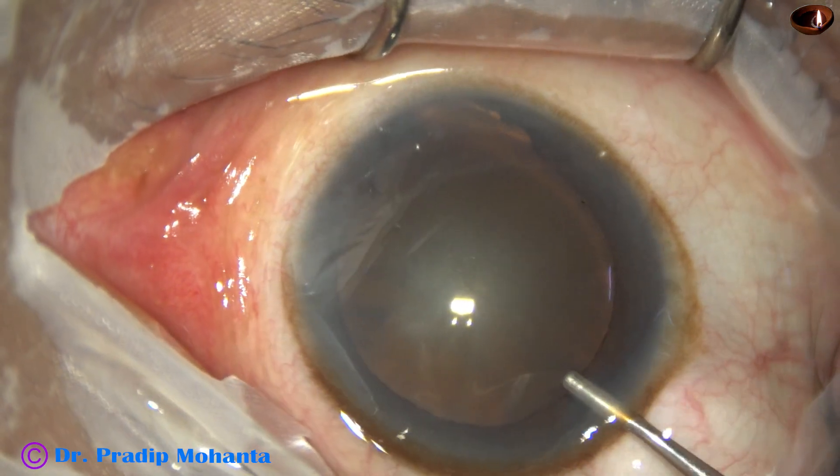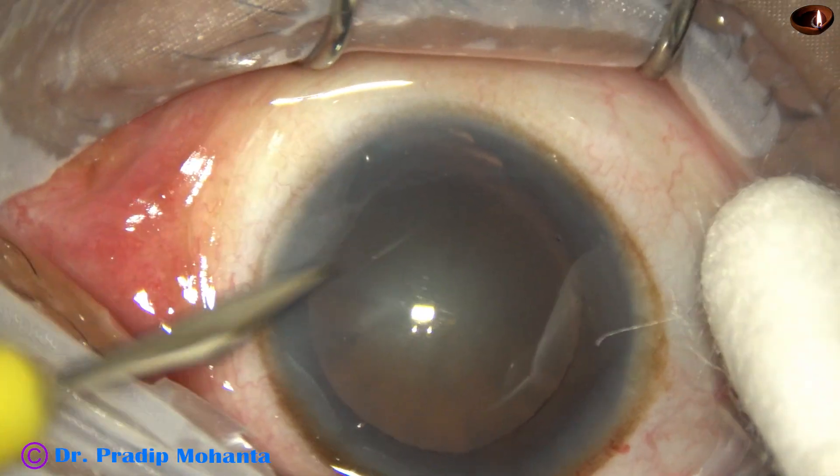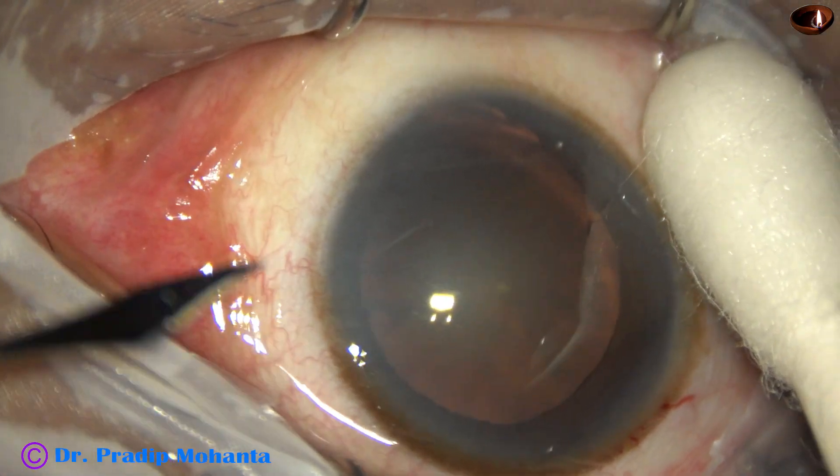The main incision is made and the anterior chamber is filled up with viscoelastic. A side port is made on the left side of the main incision, about three clock hours away.